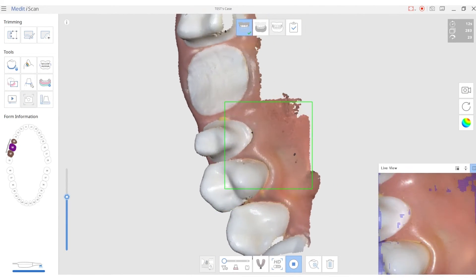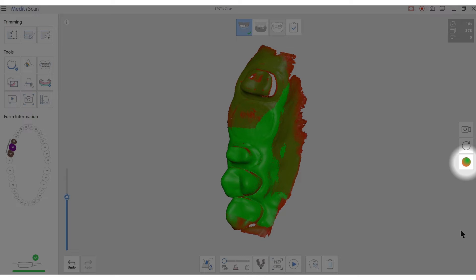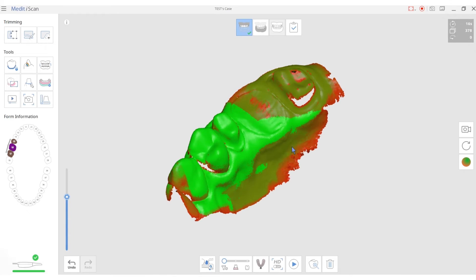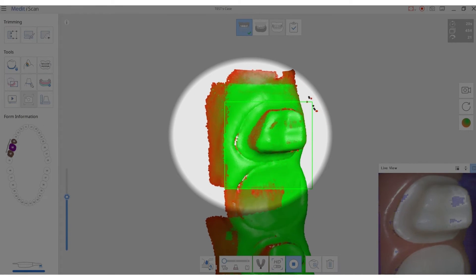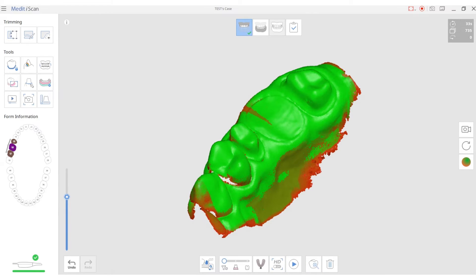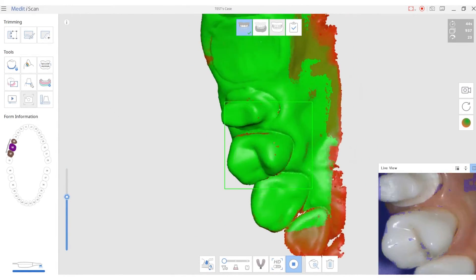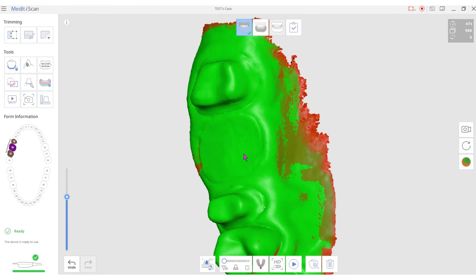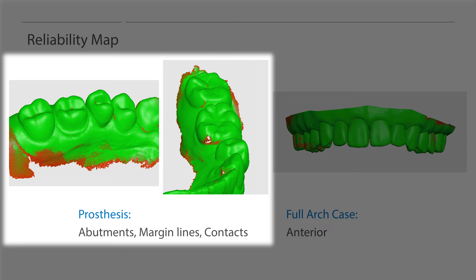When scanning a full arch case, users can immediately check if the scan data is reliable by using the reliability map. The reliability map shows how dependable the scan data is using a color map. Capturing data from only one angle will result in red or dark green data. When users scan from various angles such as the buccal and lingual surface, the scanned area will turn bright green. The brighter the green, the more reliable the scan data is and the data can be confidently sent to the laboratory. Red means that the scan data is insufficient and requires additional scanning. Critical areas such as abutments, margin lines, and contacts must display the light green color when scanning.